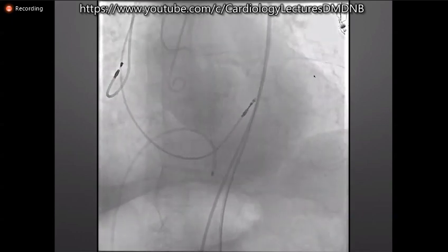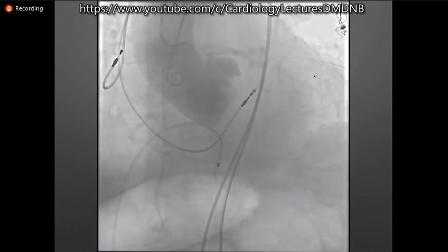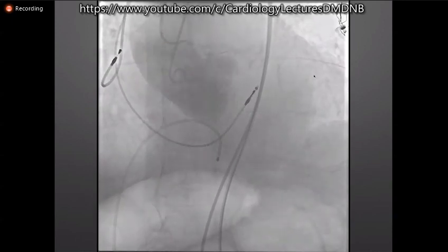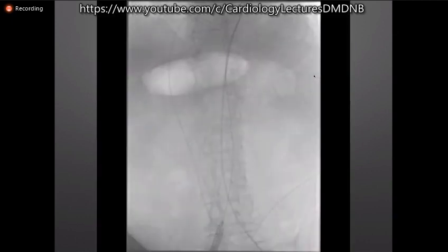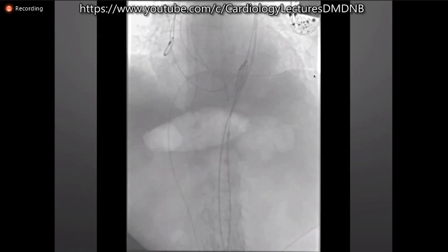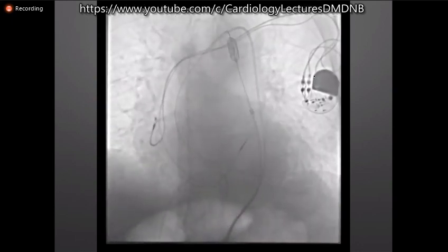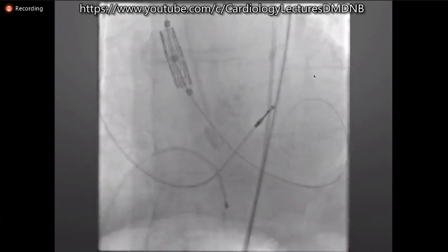We tried to enter the valve, unsuccessfully, the first few tries. So we did the angiogram. We saw the calcification, we saw the hole, so we proceeded with the case. We crossed the valve. We thought we would not do predilation in this case because we wanted to get good anchoring of the valve. We used the benefits of this Navigator system. We crossed the arch quite easily, and then we tried to cross the valve.